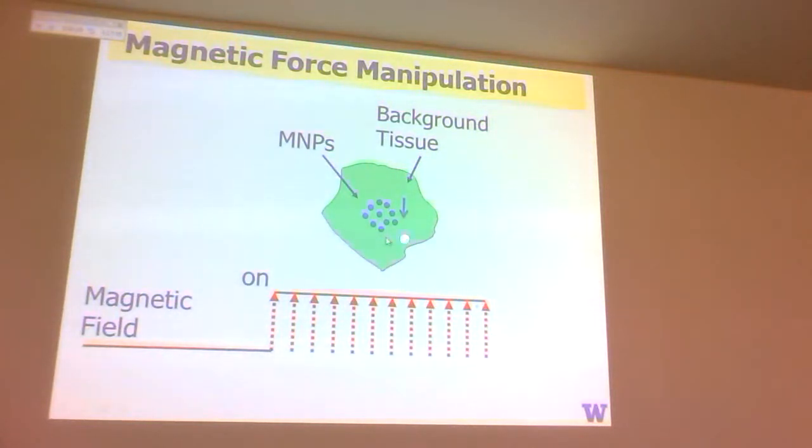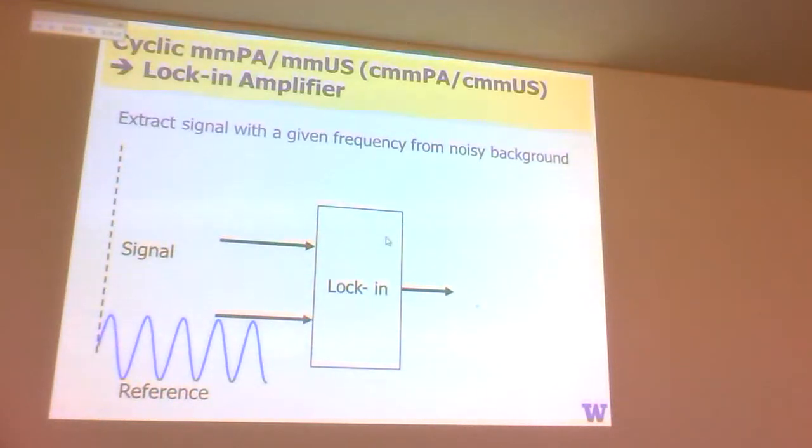So you have a force which is proportional to the field strength, or gradient in field strength, and so you can displace those particles. Okay? Now, it's displacing at the micron scale at depths on the order of a centimeter, but you can displace them. You turn it off, they'll move back. Right? Everybody get that? Moving them. Okay, what if you did the following?